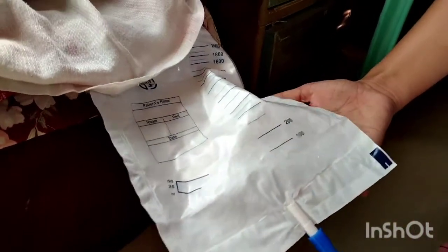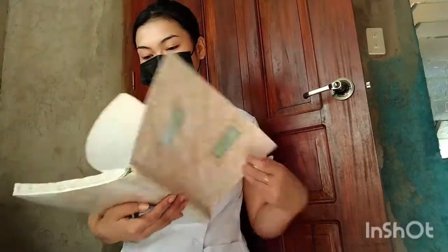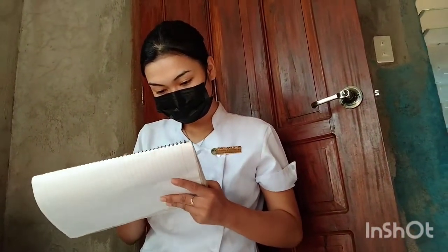Next step is to palpate bladder and ask if client remains uncomfortable. This determines if distension is relieved. Observe character and amount of urine in drainage system. This determines if urine is flowing adequately. Last is to record the type and size of catheter inserted, amount of fluid used to inflate balloon, characteristics of urine, and amount of urine. This communicates pertinent information to all members of the healthcare team.